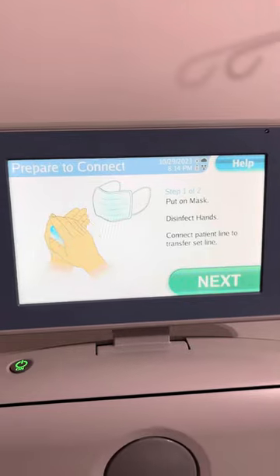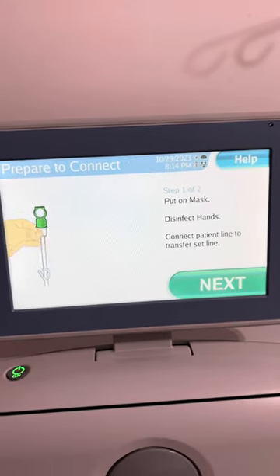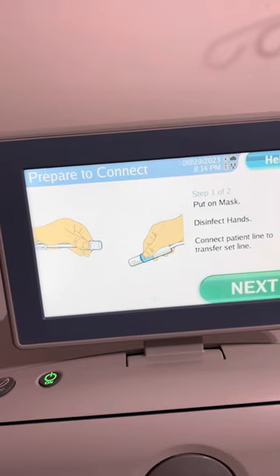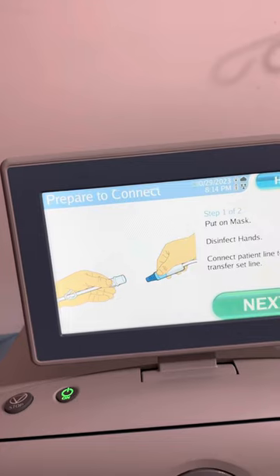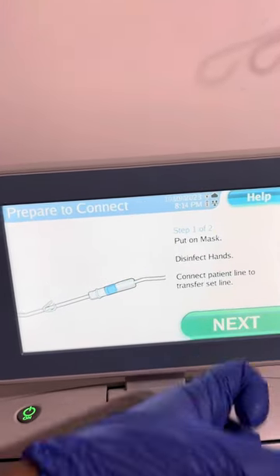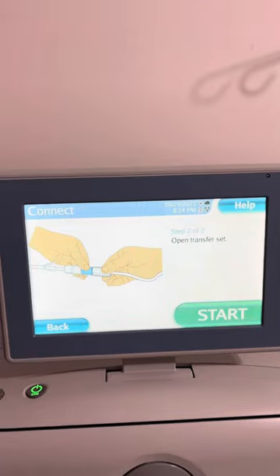Put on mask and disinfect hands, then connect the patient line to the transfer set. Open transfer set.